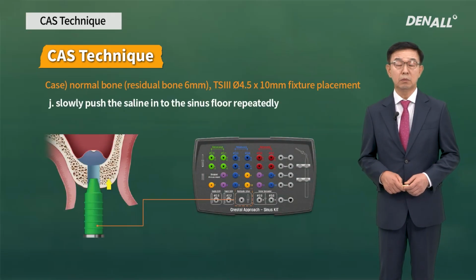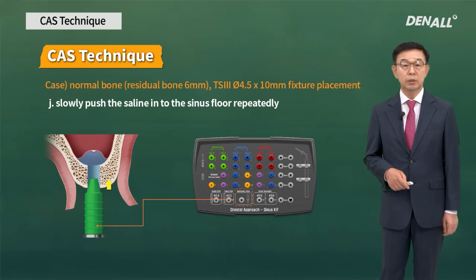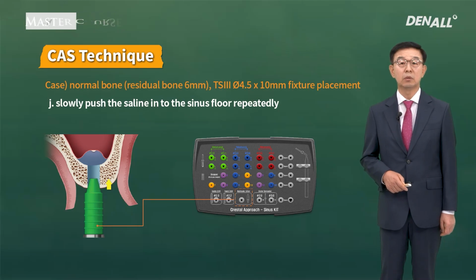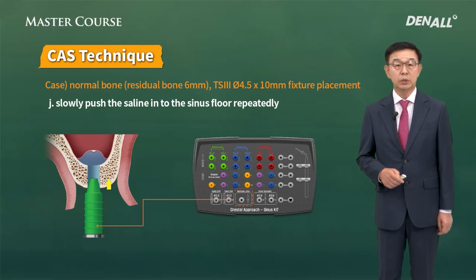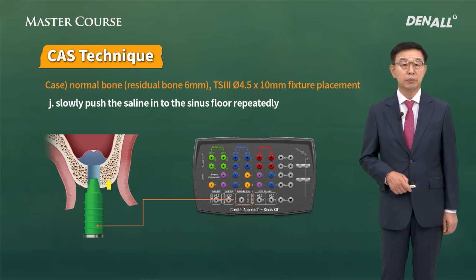Push the saline. At times, hydrolift can be done very easily. In other cases, that may not be the case. In the case of the latter, you need to have patience and push and pull repeatedly, gradually increasing the amount to do the hydrolift.